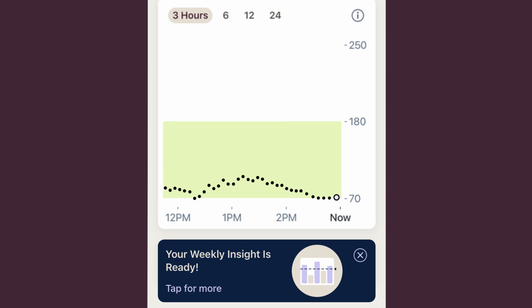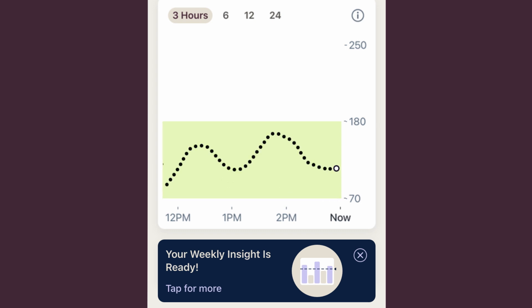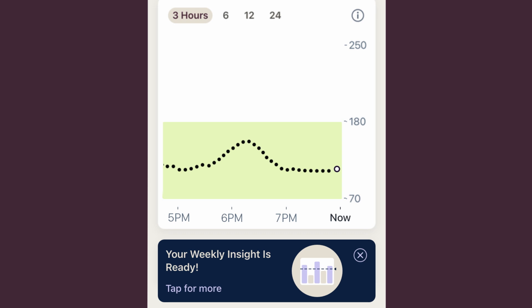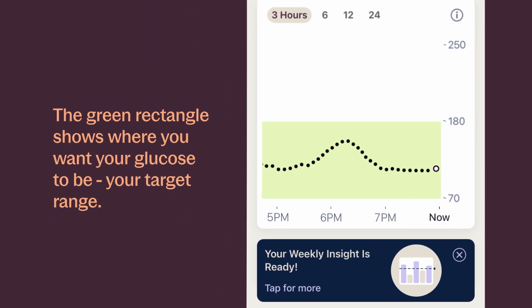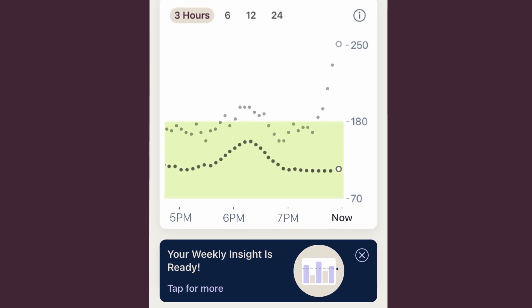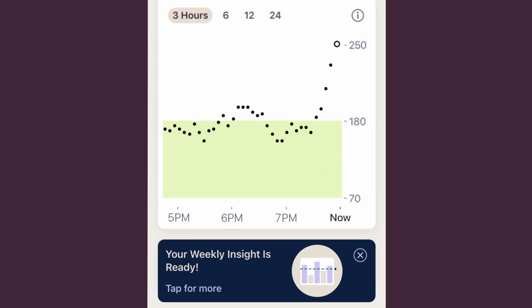You can use this information to help you reveal what causes your glucose to change. For example, does your glucose go down after a walk? How does your glucose change after different meals? The green rectangle shows you where you want your glucose to be — your target range. If your trend dots are above or below the green area, you are outside target range at that time.